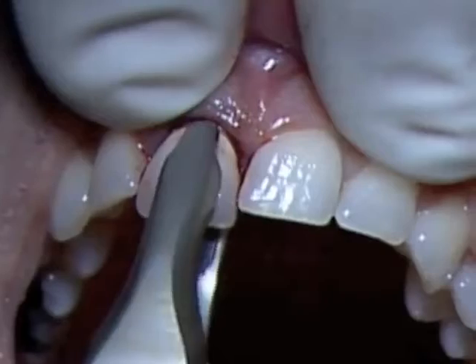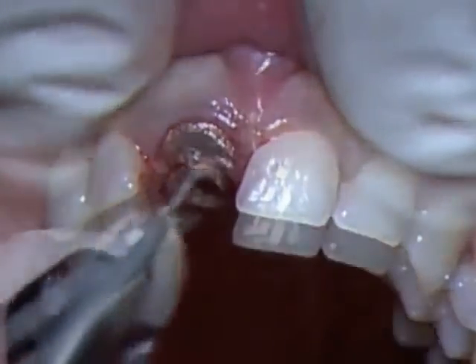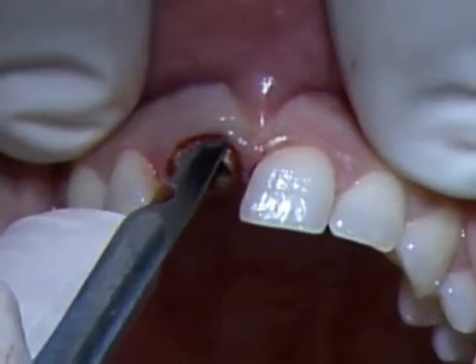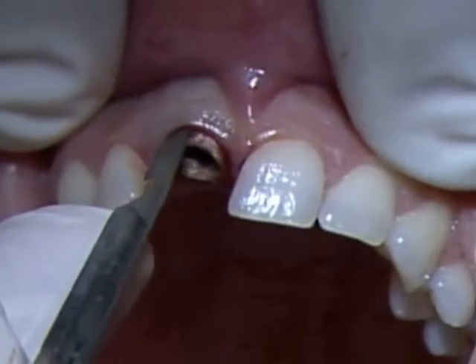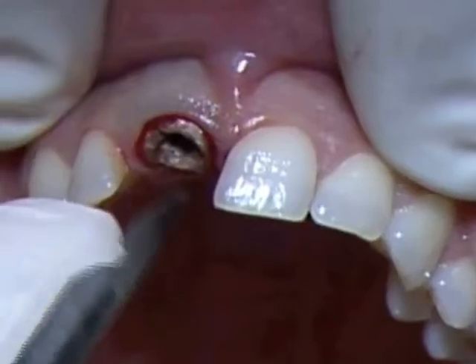We will here remove the crown and the post, as we see, and then we will use again our blade, taking advantage of the convexity of the root in order to guide the blade in the proper direction.